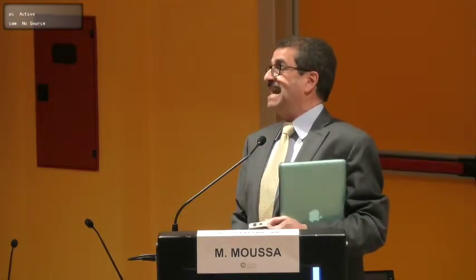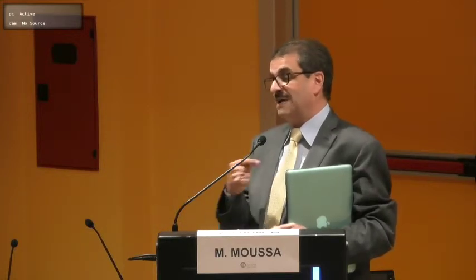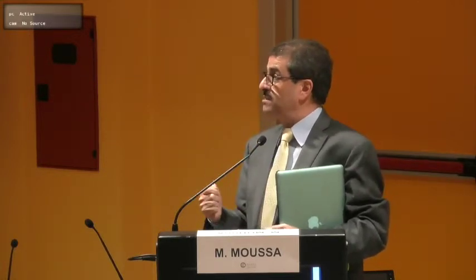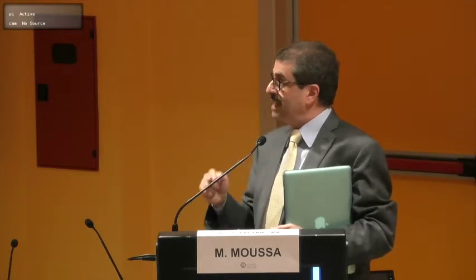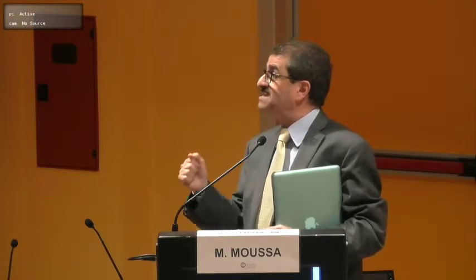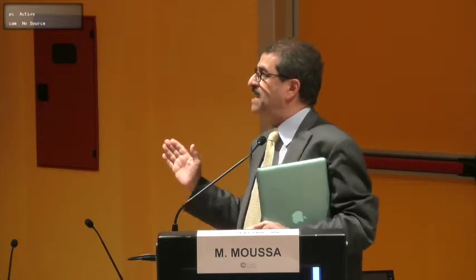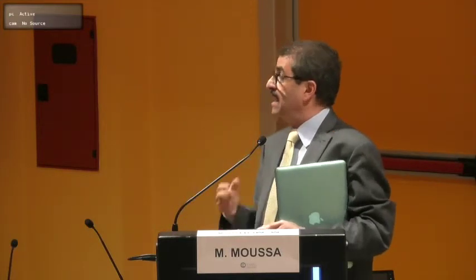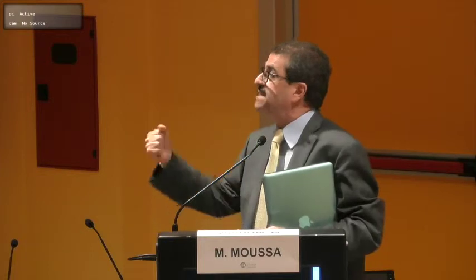I did. And I had an argument in Madrid last month when I presented this, but I cut off a movie. I have a movie for this showing that there is a telangiectasia around the fovea, but again, foveal cysts nowadays can be surrounded by deep capillary plexus dilatation by pushing of the cyst to the deep capillary plexus with dilated capillaries. And I thought of schisis, I'm sorry for the telangiectasia, but it's still an option, in addition to the foveal cysts, because we don't see that cyst.